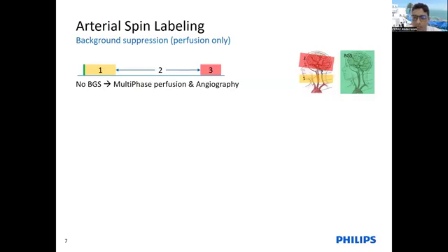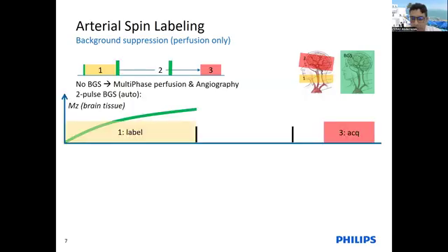Background suppression aims to minimize this effect by making sure that there is as little background signal as possible, to avoid contamination. We aim to minimize the signal of tissue with a range of T1 in seconds, which can be done with multiple background suppression pulses, with the labeling duration, and also the post-label delay. In practice, they also need to fit in the post-label delay.